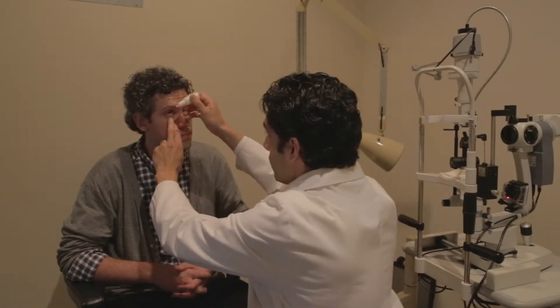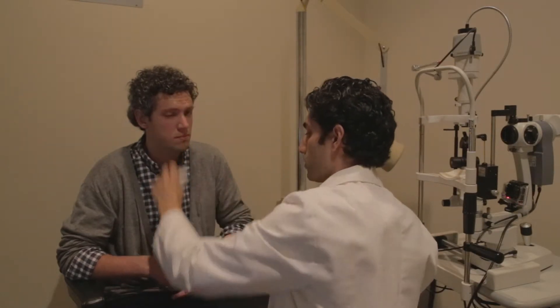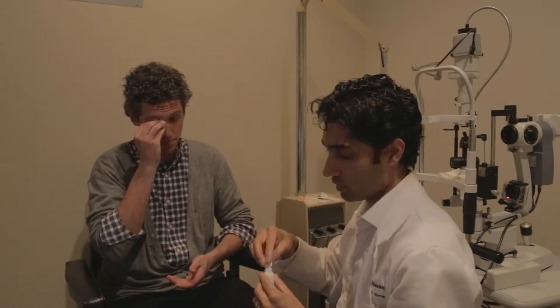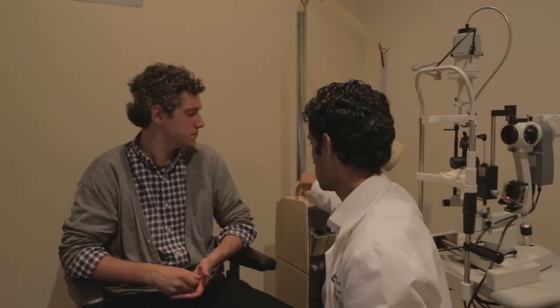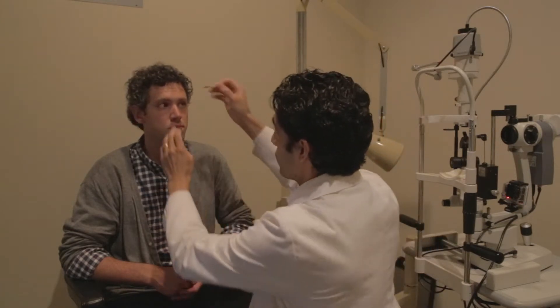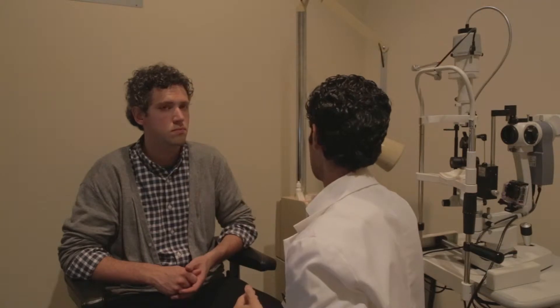First we're going to start by applying some topical anesthetic. Then you'll want to put in a little bit of fluorescein dye, which will help to illuminate the mires we're going to look at. You'll find these little strips called florets — they have some dye impregnated on paper. Just dab that on the eye and blink a few times.